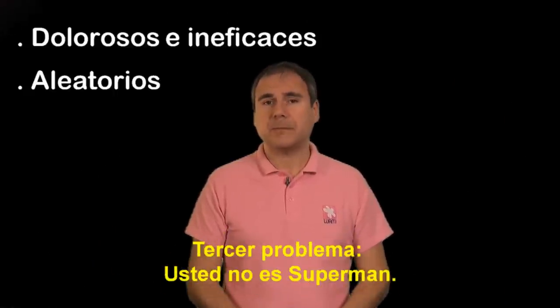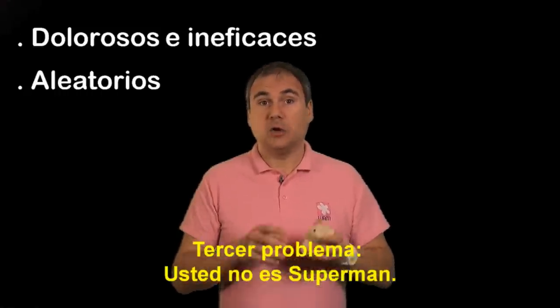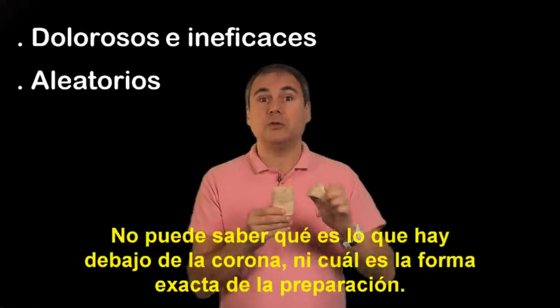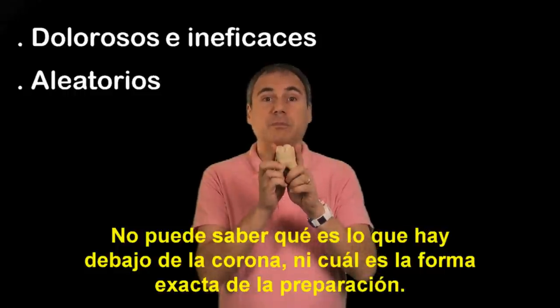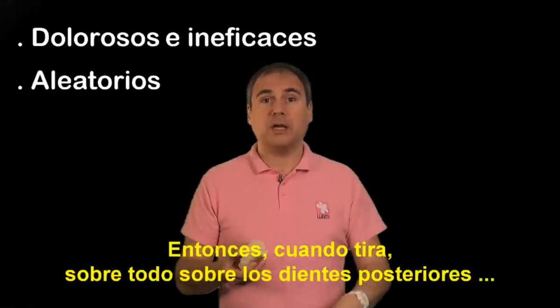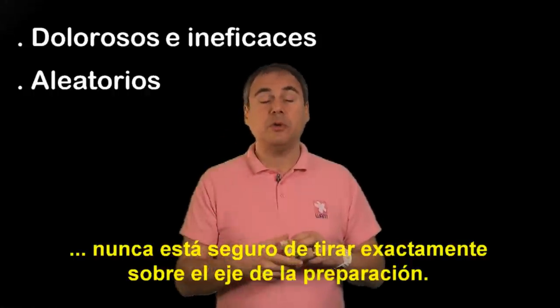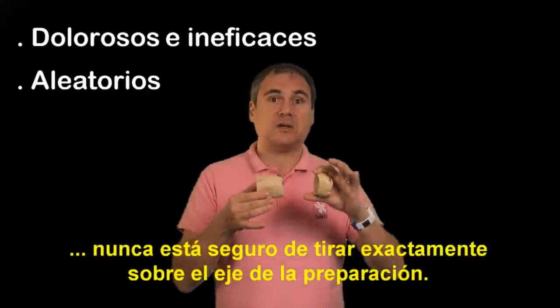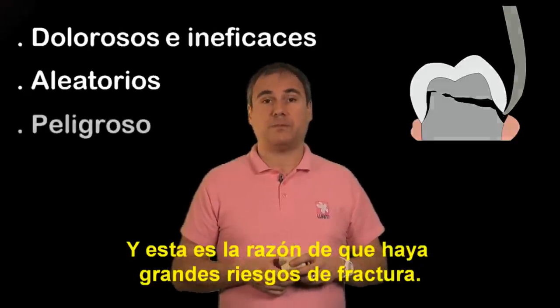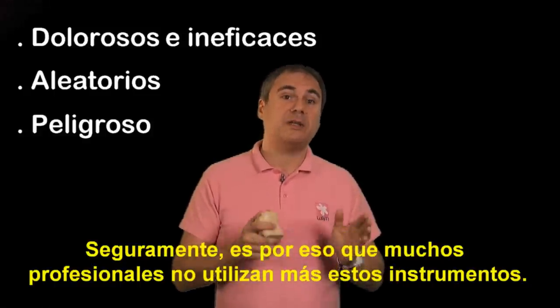The third problem is that you are not Superman. You can't see through the crown, you can't see what's under it, you can't determine the accurate shape of the preparation. So when you pull — especially on posterior teeth — it is absolutely impossible for you to make sure that you pull along the axis of the crown, and this induces major risks of fracture.